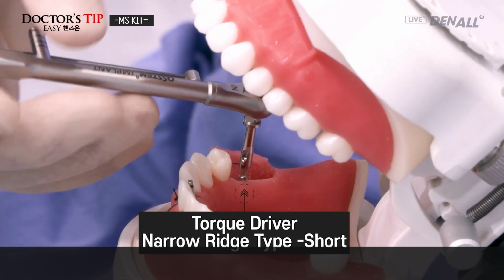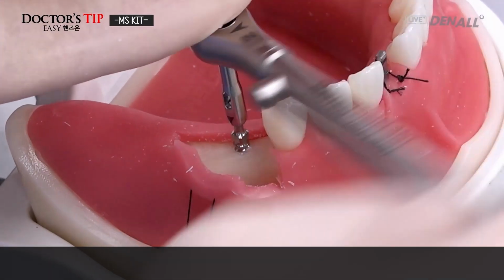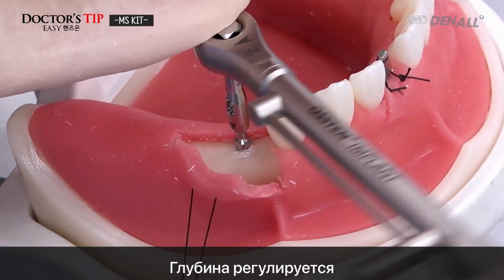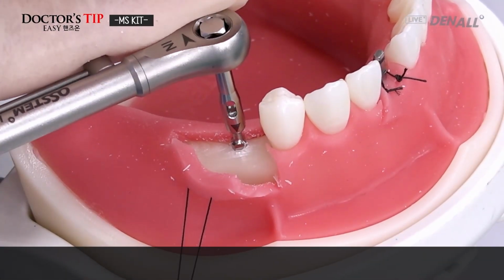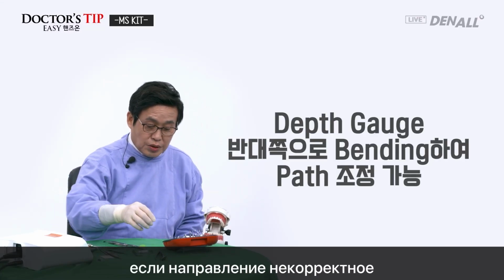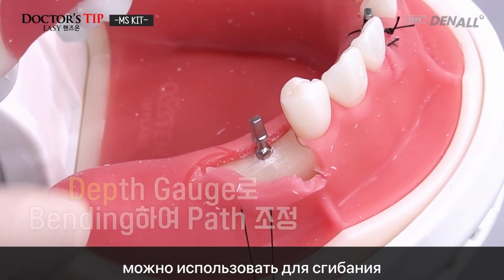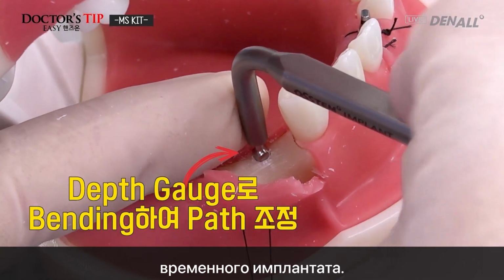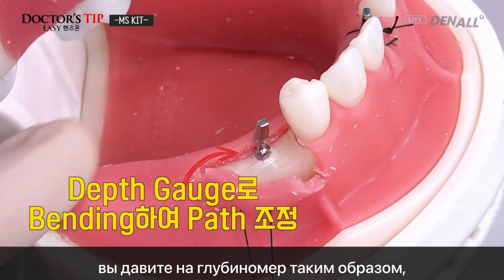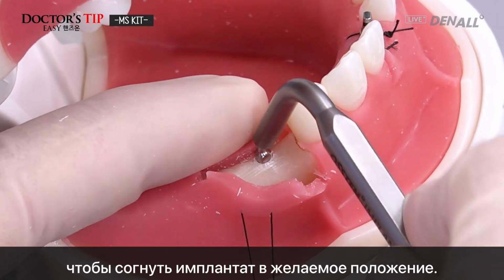Depth adjustment. So depth is adjusted. And like this, in case of a provisional, if the path is not correct, the backside of the depth gauge can be used. For a provisional implant, if you don't like the positioning, then you push in the depth gauge like this to bend the implant to the position that you want. Like this. Again, it's bendable.